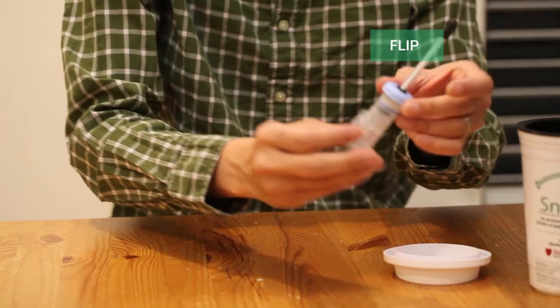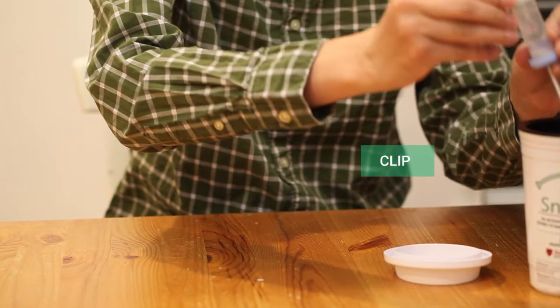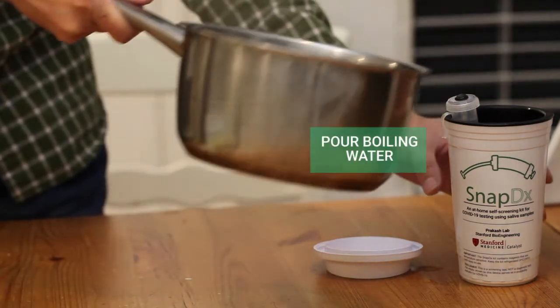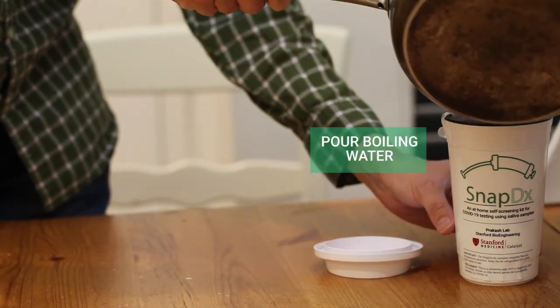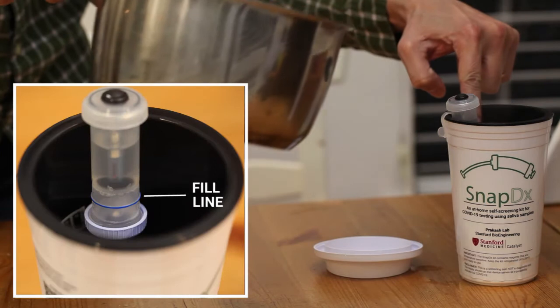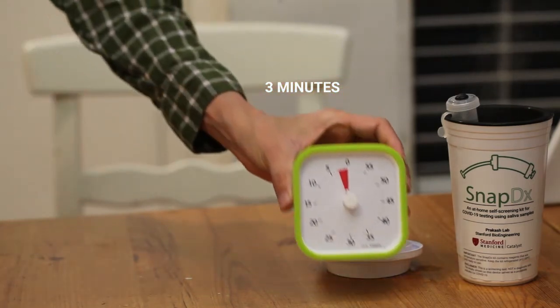Step 2. Clip the SnapDx tube so that the clear cap is on the top. Use the clip on the outside of the tube to hang the SnapDx tube on the inside rim of the provided cup. Once the water has boiled and you can see bubbles forming on the surface, pour the water into the provided cup until it reaches the same fill line as indicated on the outside of the tube. Do not go beyond this fill line.